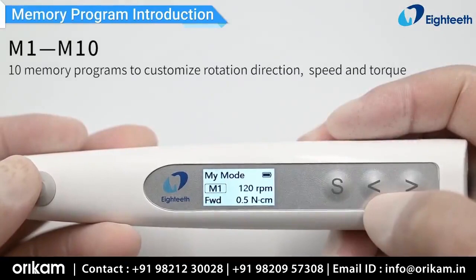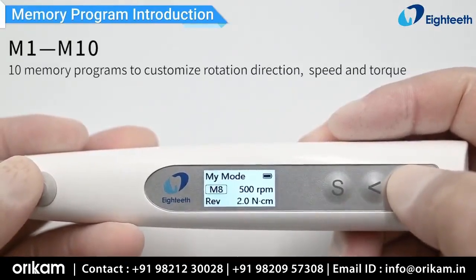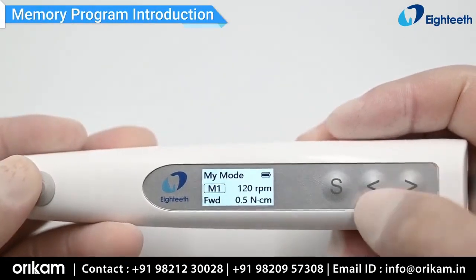There are 10 memory programs available to customize rotation direction, speed, and torque.